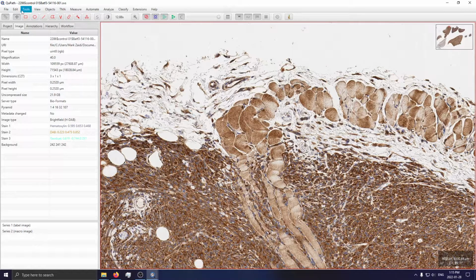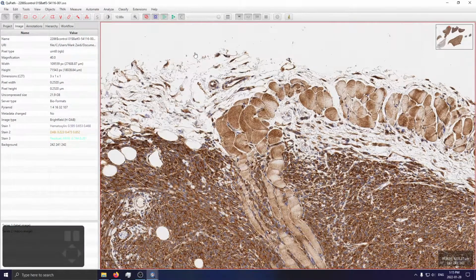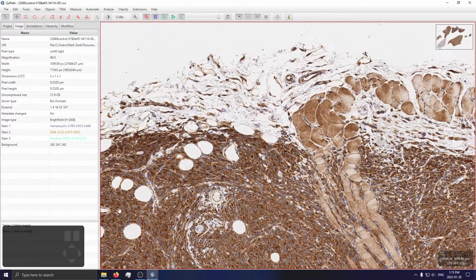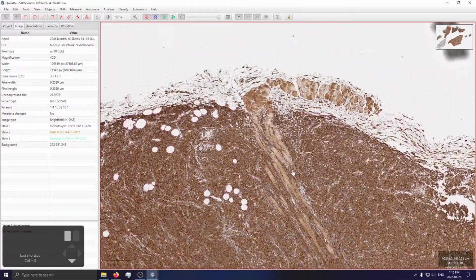For convenience's sake, and in terms of reproducibility, because I want you, the client, to be able to do this without much of a hassle, I will turn on this little input display. So anytime I do a left click, a right click, whatever, it'll show up here. Even Control S, like if I wanted to save an image. So, let me put this off screen.